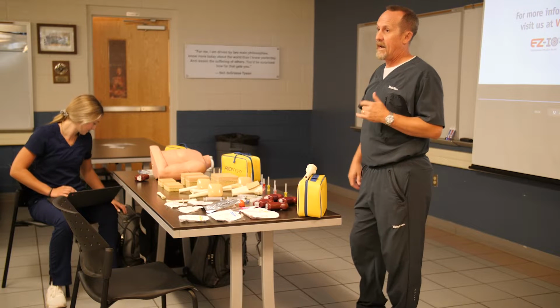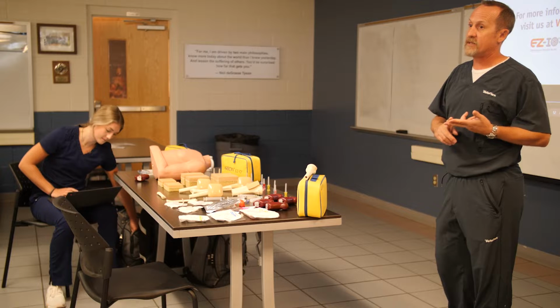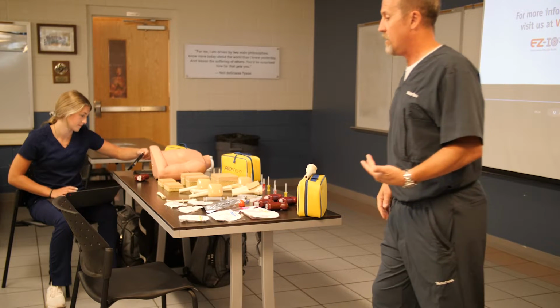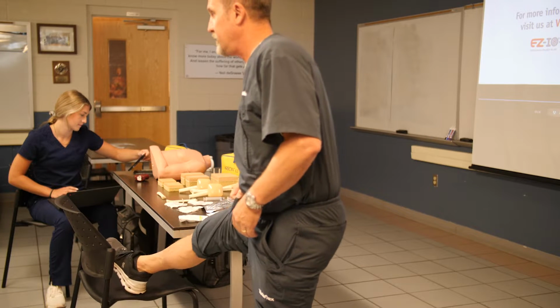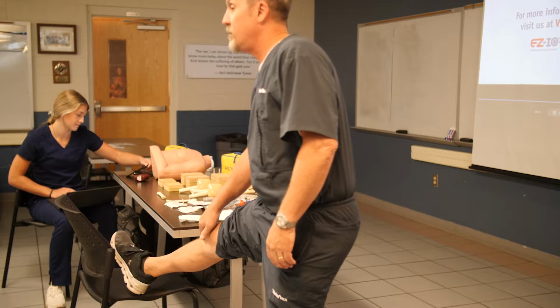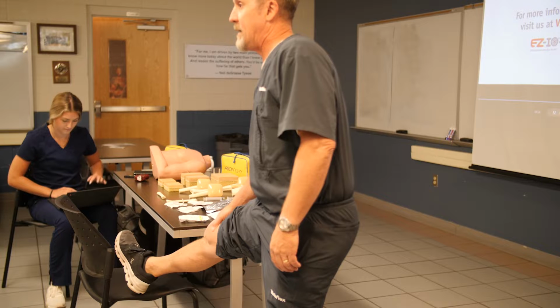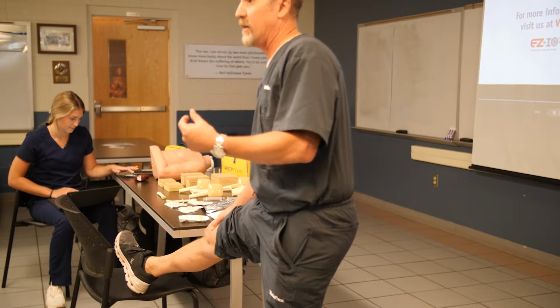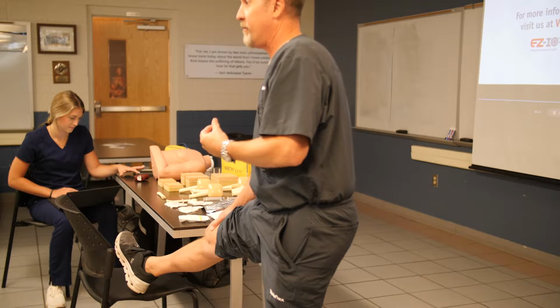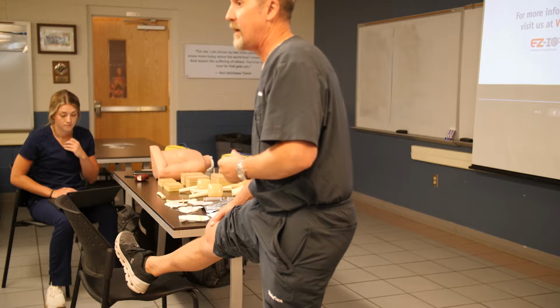Perfect. Okay, so remember, number one spot, proximal humerus. Best flow, quickest to the heart, easiest to achieve, okay? So now in adult patients, when we start going lower, we can use the tibia, which I know you guys are all familiar with. A lot of people talk about using the tuberosity as your landmark. We talk about using the patella as your landmark. It's a little easier to find, especially even on little tiny babies. They have a little tiny piece of cartilage in there. They may not have a fully formed patella, but they do have some sort of patella in there. And so this is going to be your better way to landmark them.